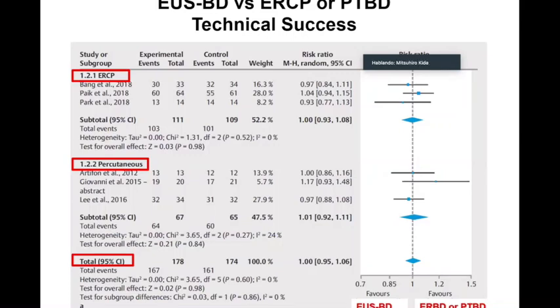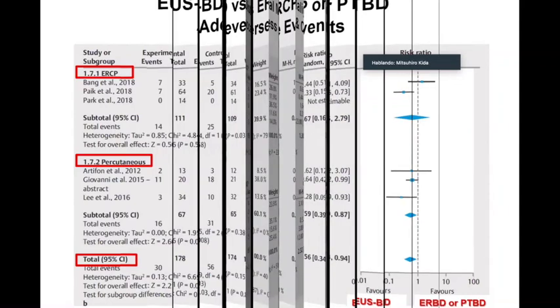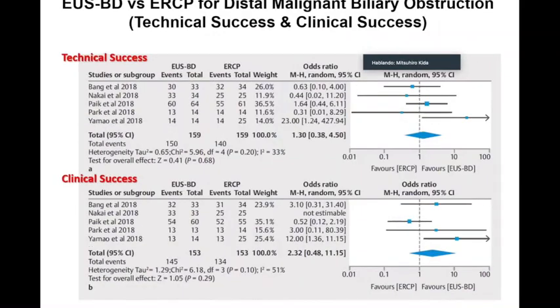However, concerning adverse events, compared with ERCP there is no significant difference, but compared with PTBD, PTBD has many more adverse events. This is for distal malignant biliary obstruction.